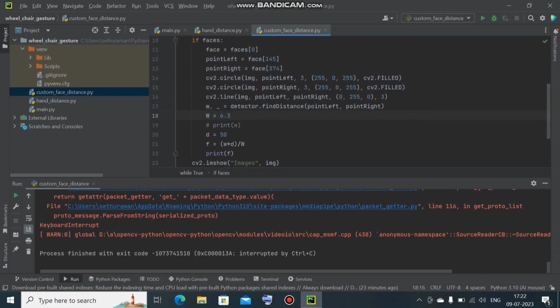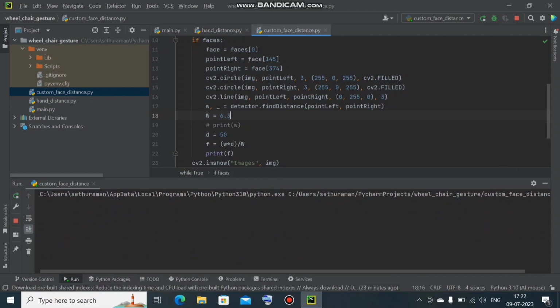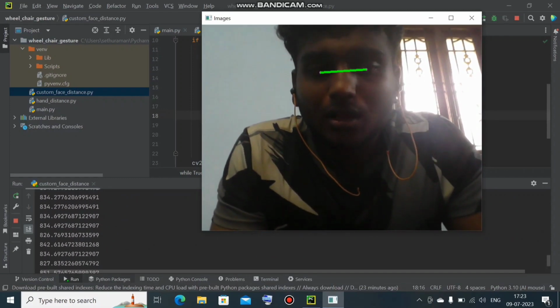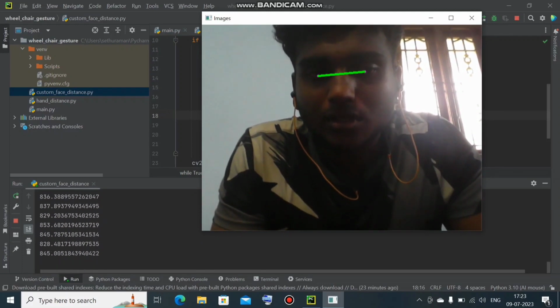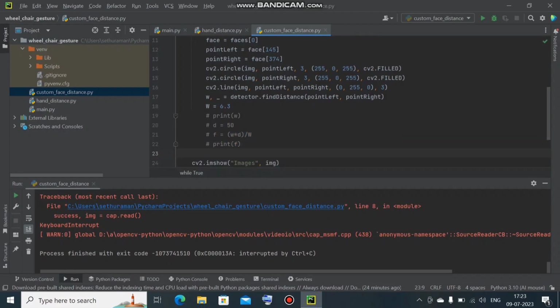Now let us find the focal length value when we sit accurately 50 centimeter from our webcam, and let us see what focal length value we are getting. Let us run that and see. From 50 centimeter I'm sitting, it is around 840. I'm commenting this out now. Our motive is to find the distance. You can see here f equals small w into d by W. So if we need to find distance, you can change the formula to f into capital W divided by small w. So you can easily find your distance.